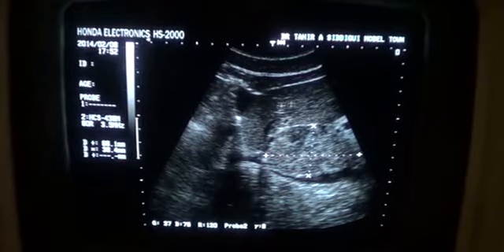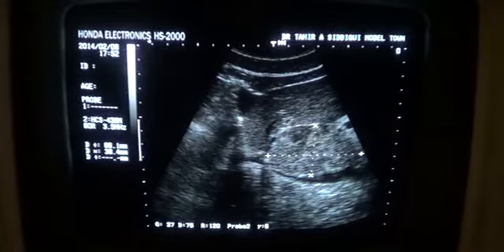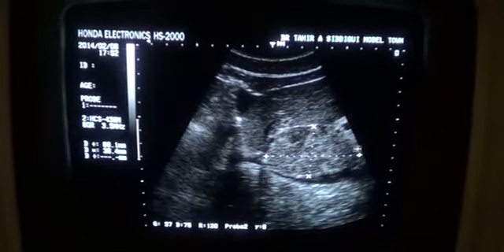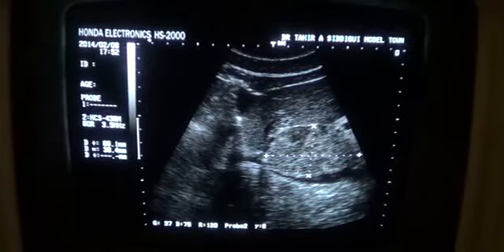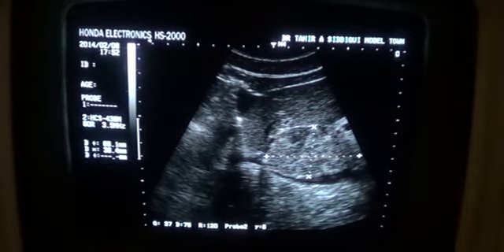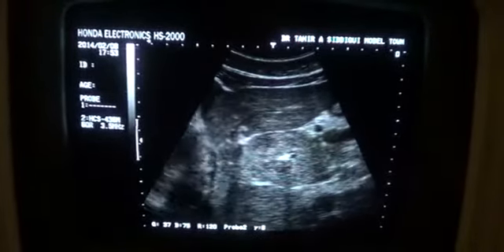This is the left lobe of the liver in longitudinal section, and as we know, the caudate lobe of the liver, or segment 1, is bounded anteriorly by the ligamentum venosum. Posteriorly the IVC courses it. So this is the caudate lobe of the liver.